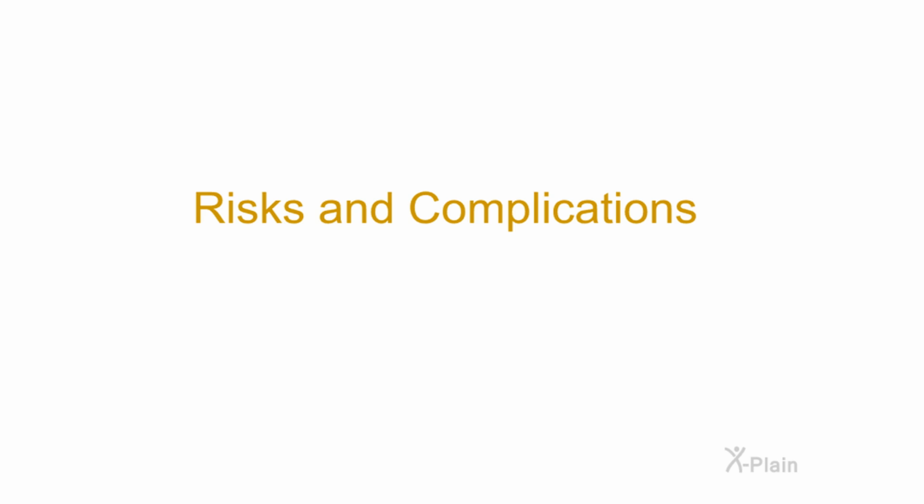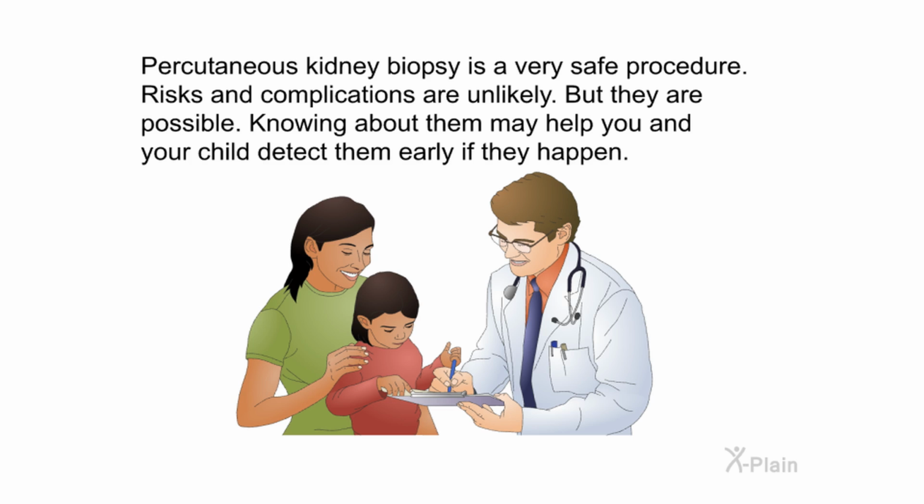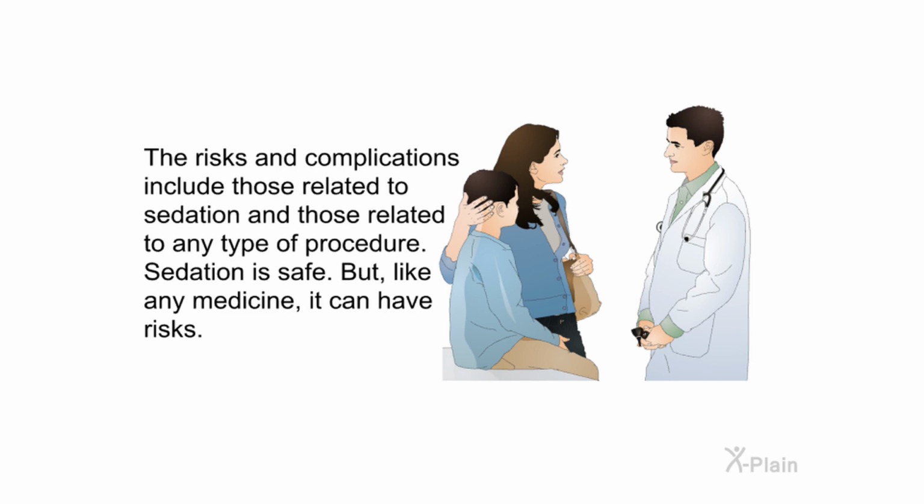Risks and complications. Percutaneous kidney biopsy is a very safe procedure. Risks and complications are unlikely, but they are possible. Knowing about them may help you and your child detect them early if they happen. The risks and complications include those related to sedation and those related to any type of procedure.